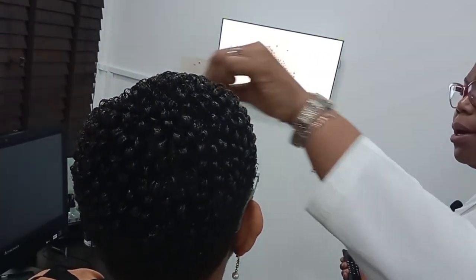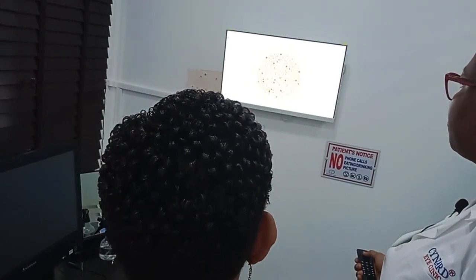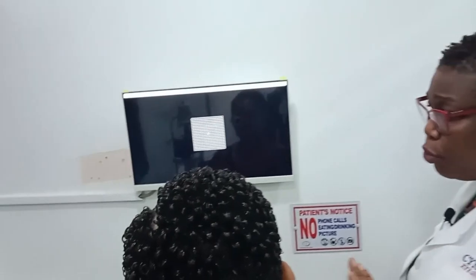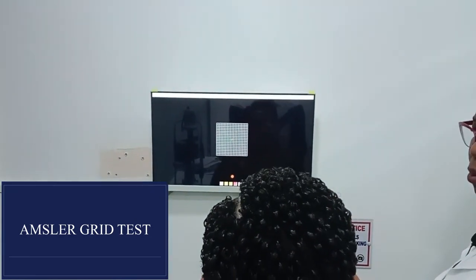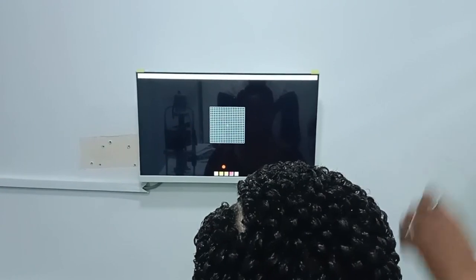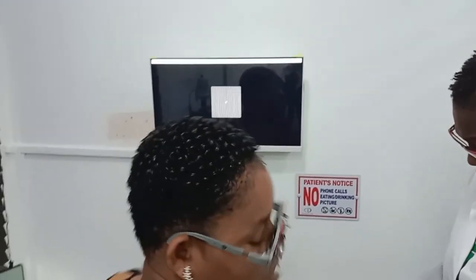The right eye. Let's see. All are straight, no broken lines. Okay. What about here? Same thing, no broken lines. And here, no broken lines. That's okay. You can have a seat.